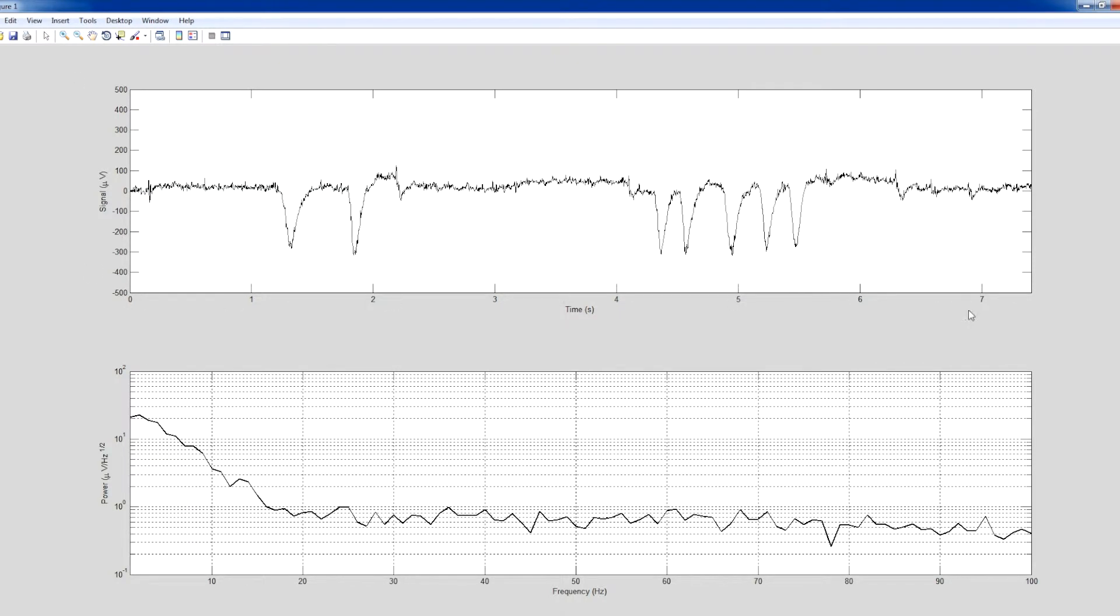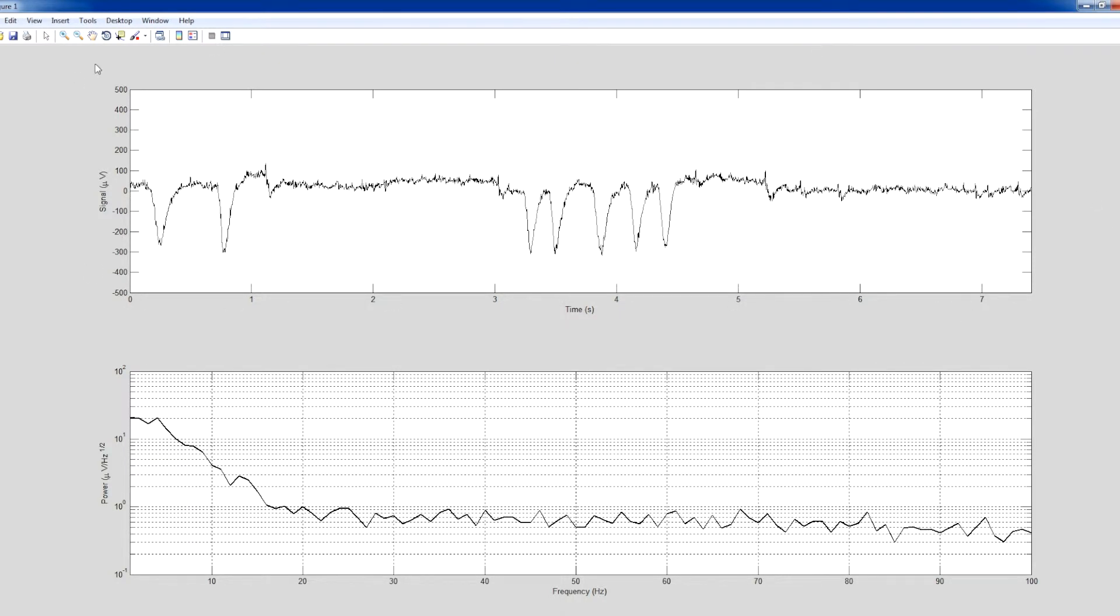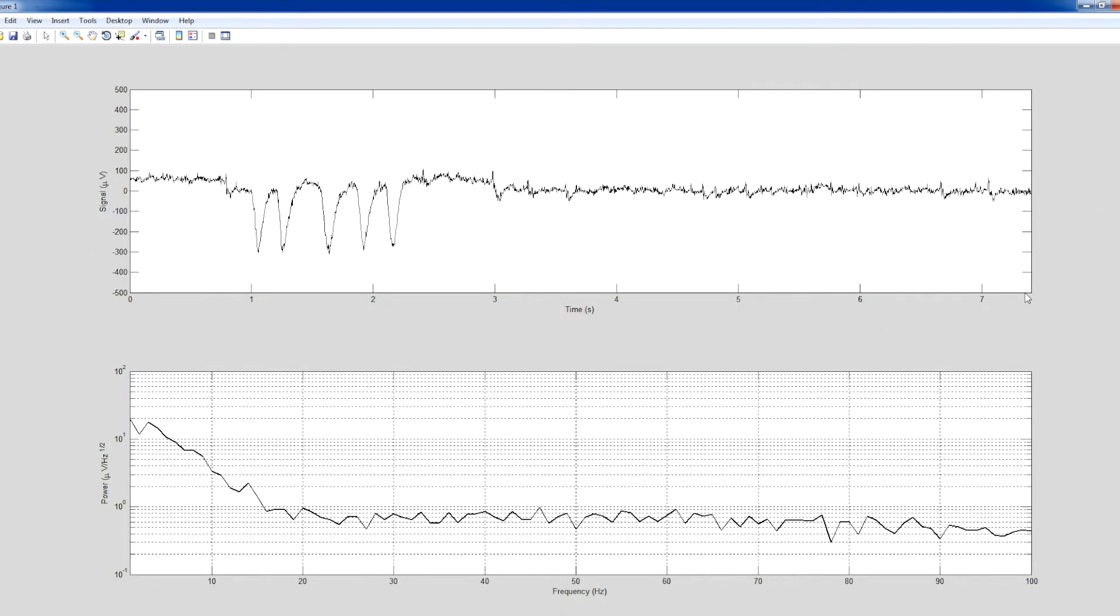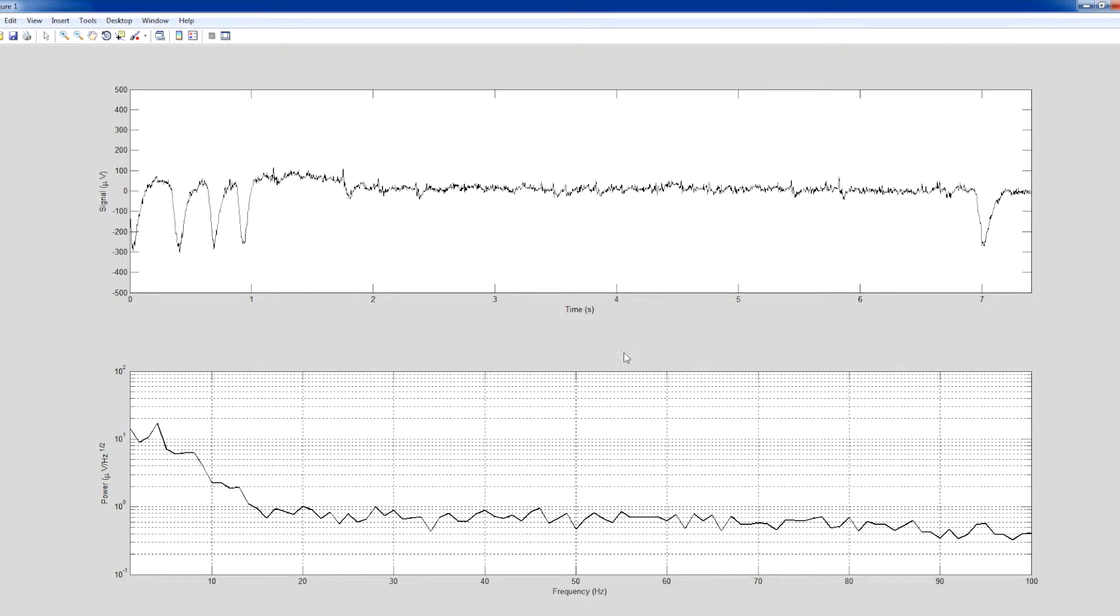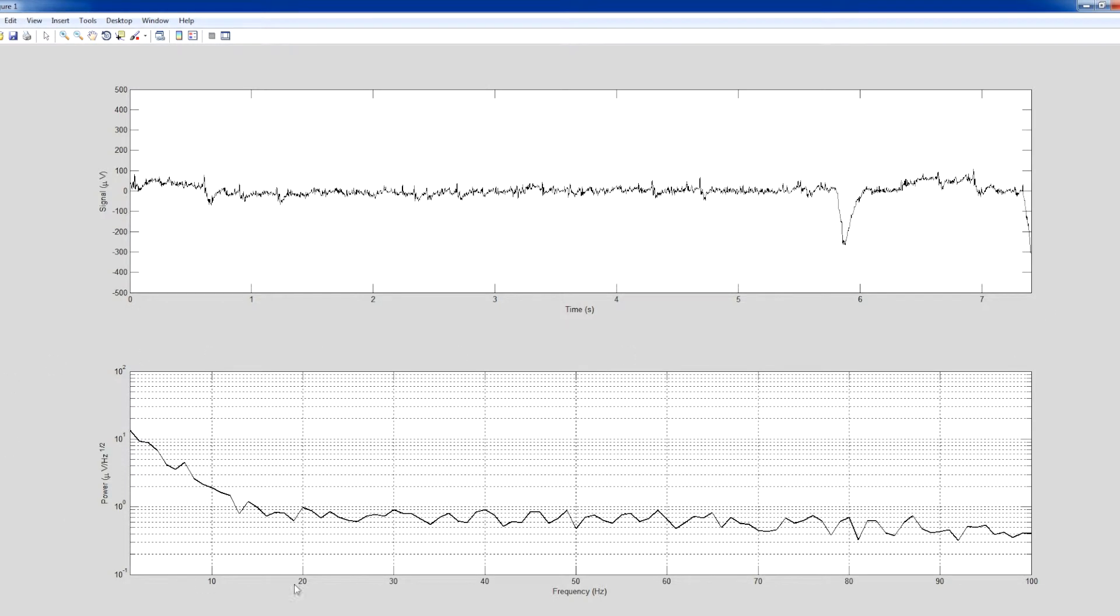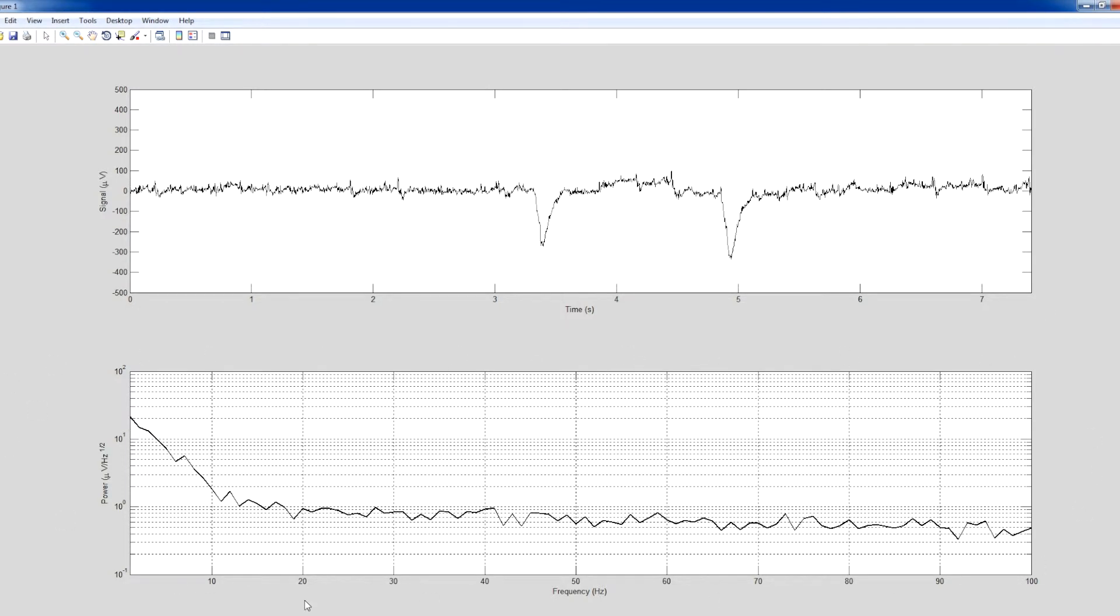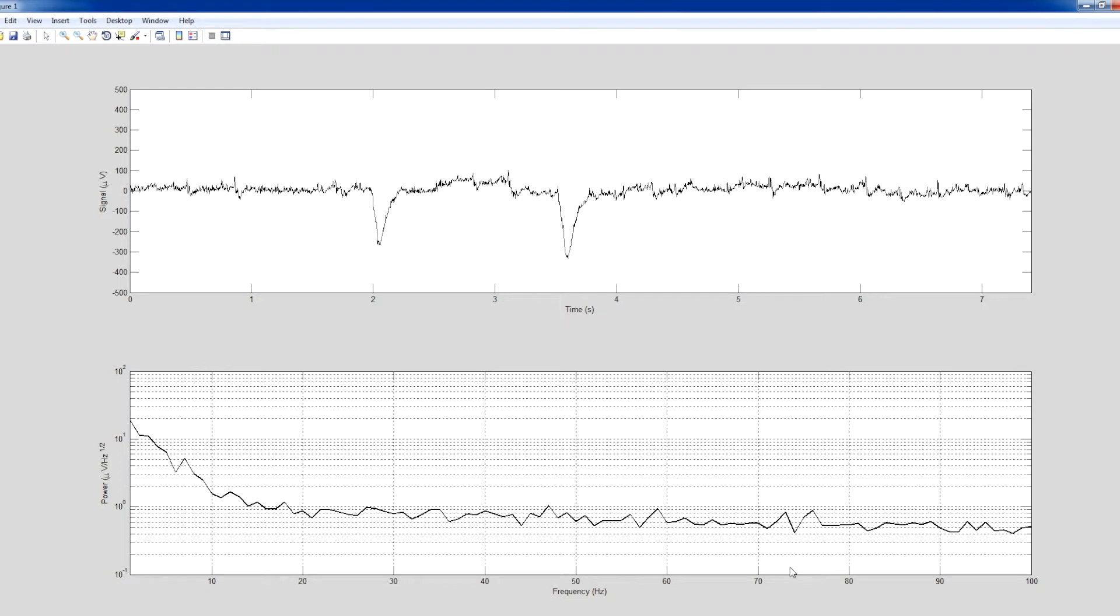This is also a good demonstration of the signal quality from a Cognitix system. The incoming EEG is unprocessed from DC up to the anti-alias filter at 130 Hz.